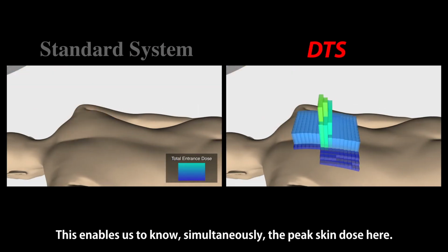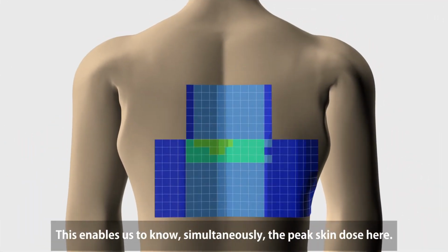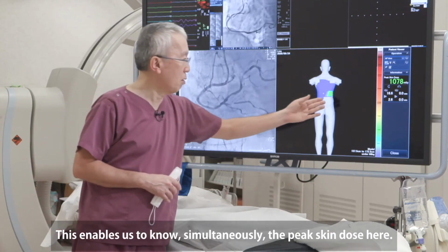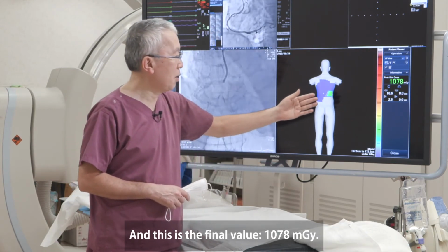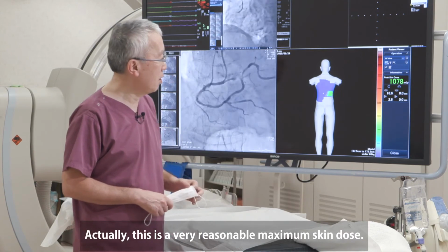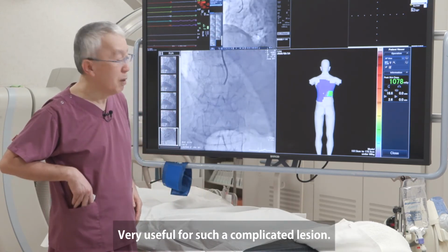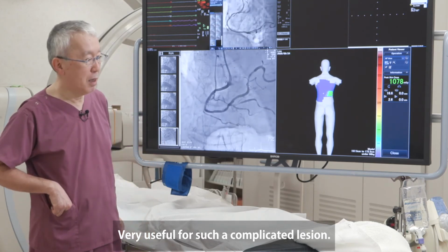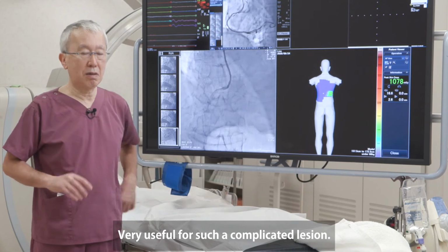This enables us to know the peak skin dose simultaneously. And this is the final value at 1078 milligray. Actually, this is a very reasonable maximum skin dose for such a complicated lesion.